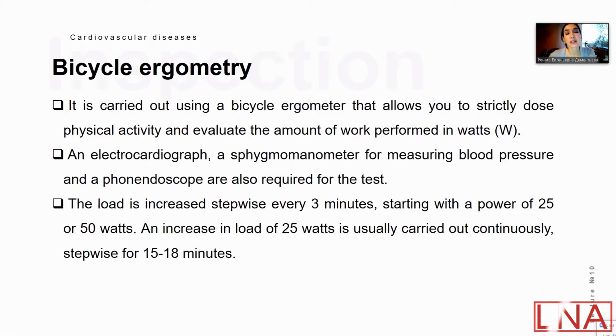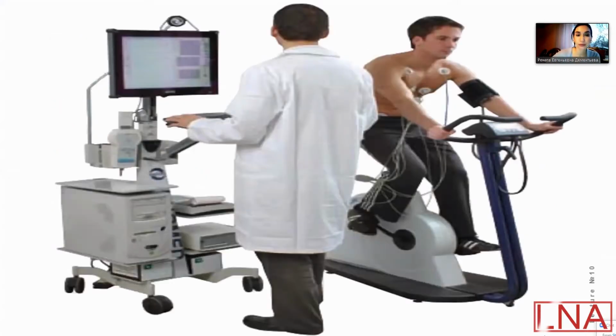The load is increased stepwise every 3 minutes, starting with a power of 25 or 50 watts, and an increasing load of 25 watts is usually carried out continuously and stepwise for 15 to 18 minutes.